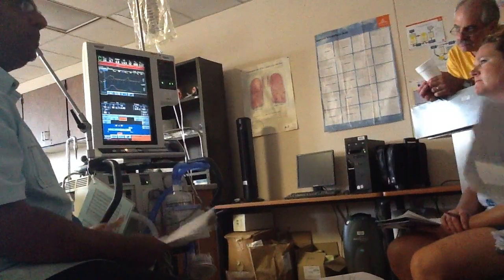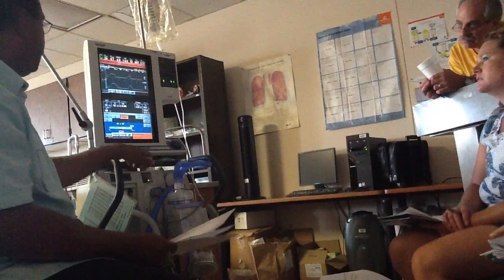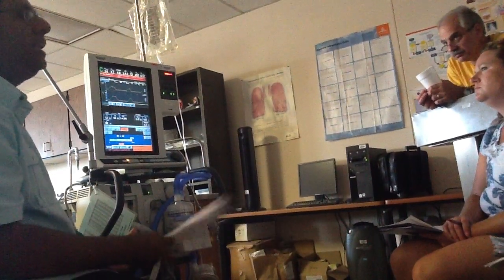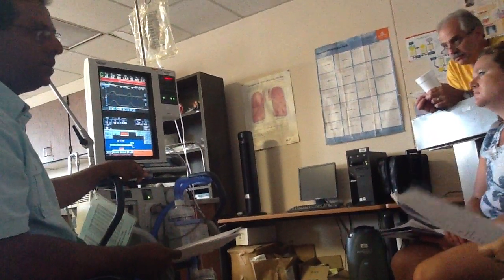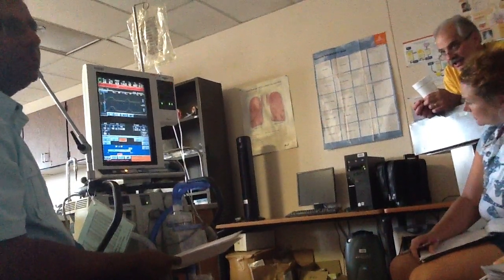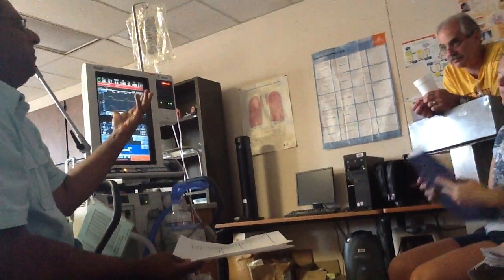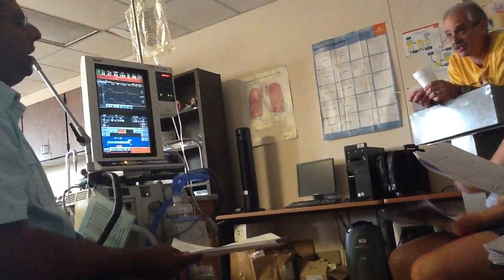Now, if the doctor comes in and changes the respiratory rate from 12 to 24, I don't have to worry about my IE ratio anymore because I got it locked at a 1 to 1 ratio. This is what they didn't do in your situation in the hospital. They left it unlocked, so when they changed the rate, the IE ratio changed. TI locking doesn't matter because the TI has to be going up and down to fix the problem.